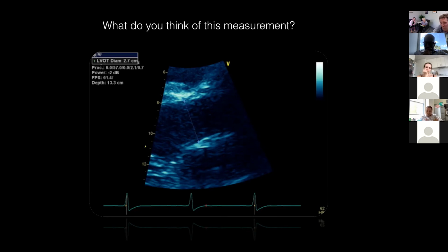Nice. And we're measuring here. We can almost see a valve there, and sorry guys, I can't point my finger. A valve there and a valve there, sort of being in the base of there. So I actually think this is one of my measurements. And the measurement sounds very big. It's really big, right? It's 2.7. So what's normal? Around 2. Yeah, around 2, right?